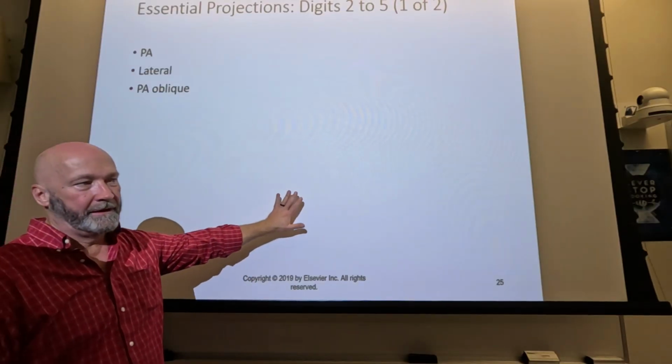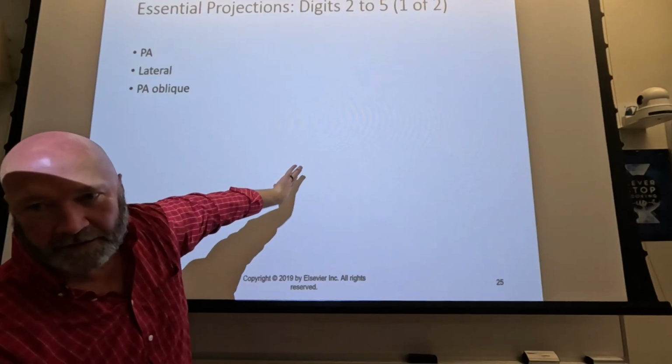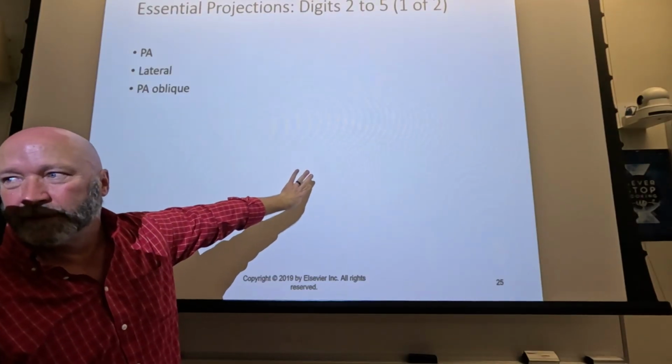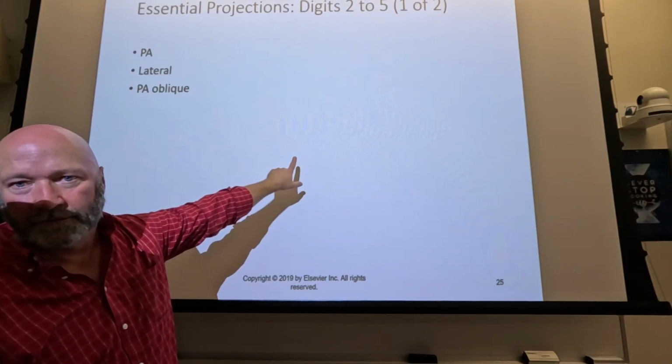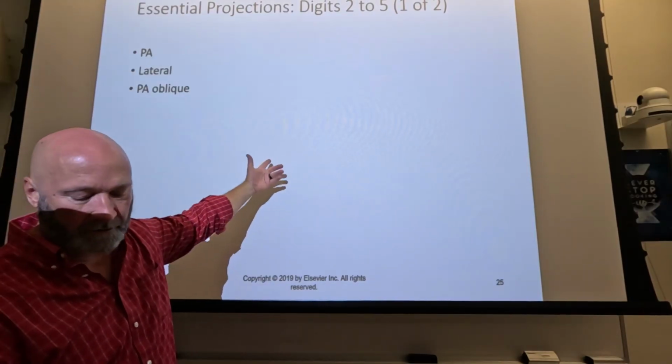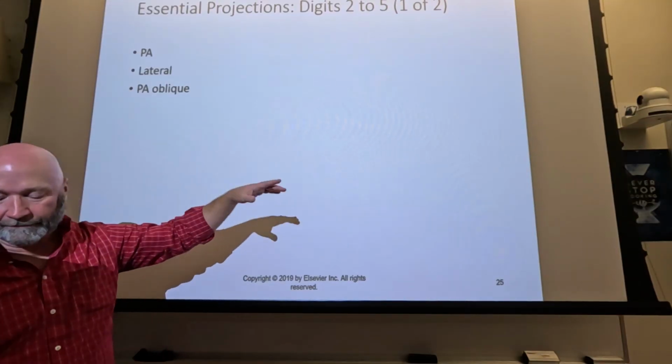Okay, well, from your body position, you're rotating internally, which would seem to be medially, right? And I think, was that the answer? No, the answer was internally. Yeah, okay. So I think internally rotated is a better answer after thinking about it for a minute.